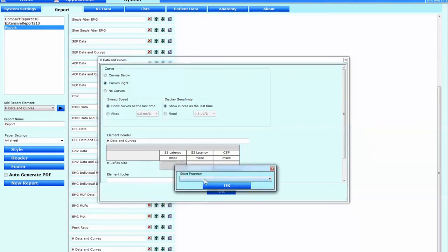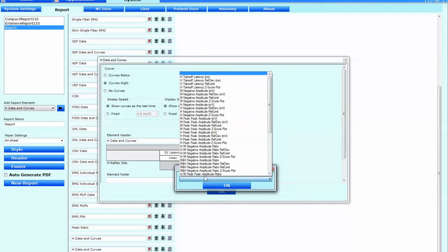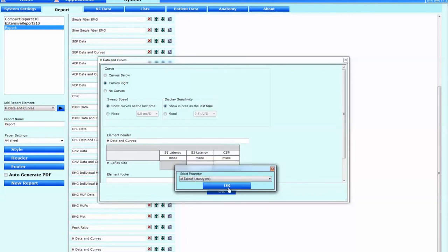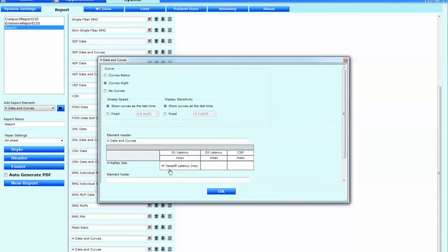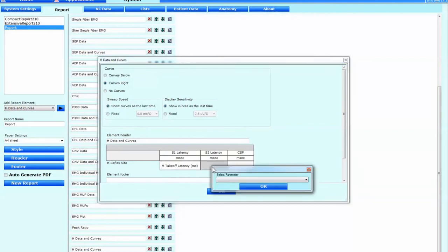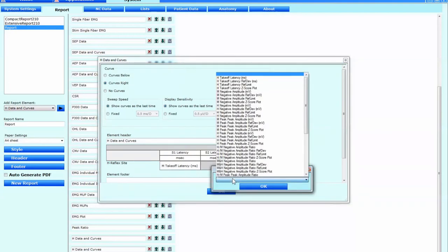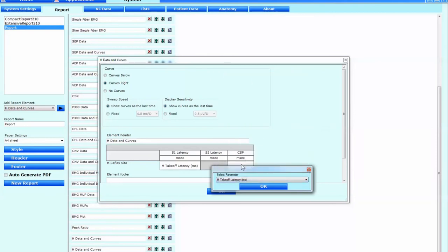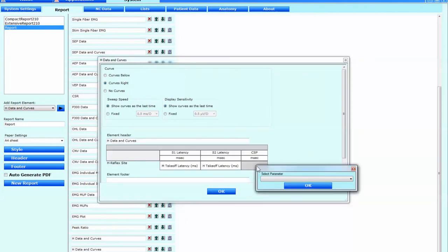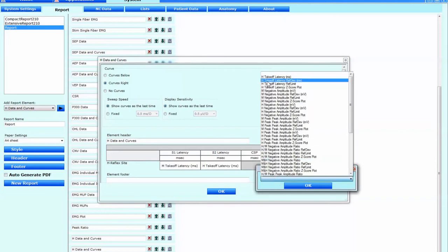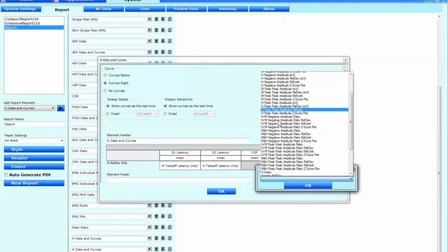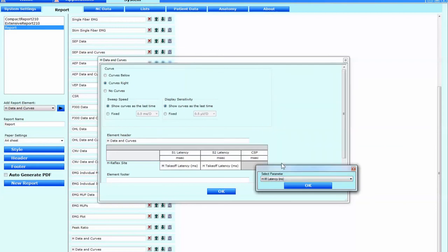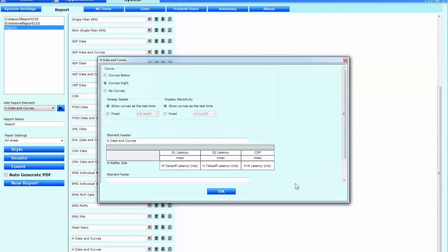And now what we're going to do is we're going to add in the parameters. So remember of course that we've used the H and M latencies. So the first one we're putting is the M takeoff latency under the S1 latency. And then for the S2 latency, no surprises, it's going to be the H takeoff latency. Click OK. And then for the difference between the two, we're going to put in the H M latency difference there. And we'll change the element header to the CSP and we'll click OK.